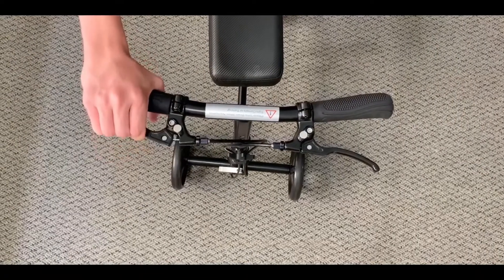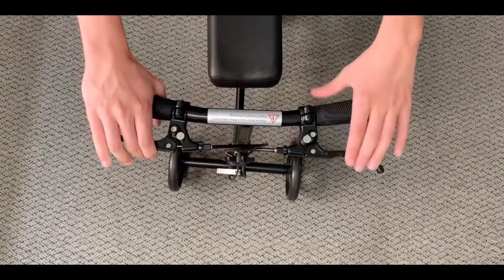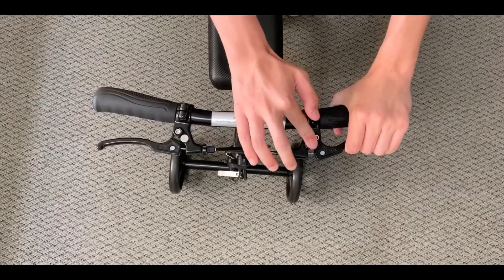The knee walker includes a dual handle mounted lockable brake system on each side based on the user's preference.